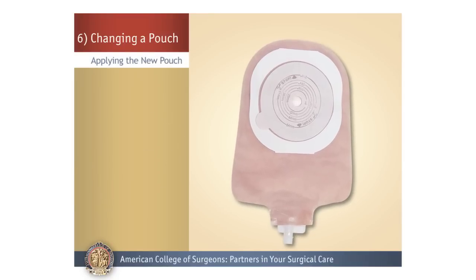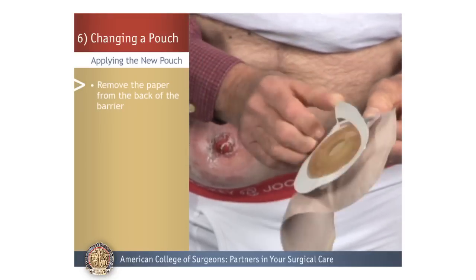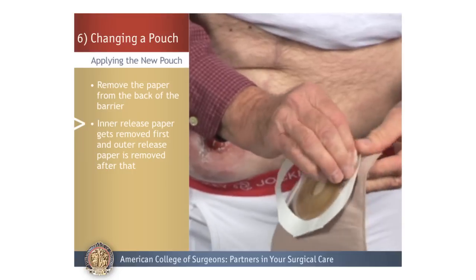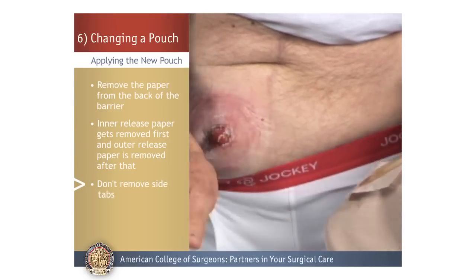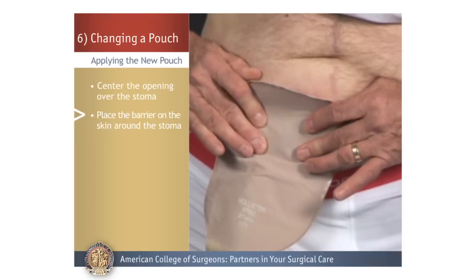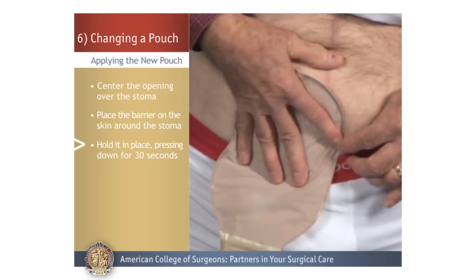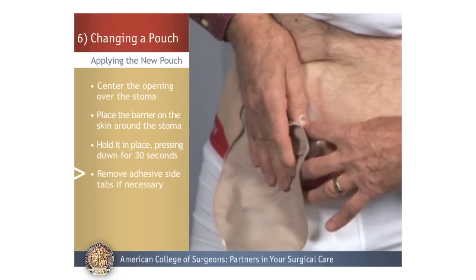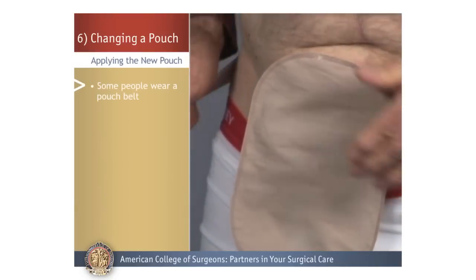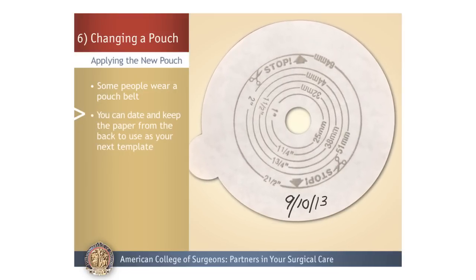Applying the New Pouch. Now you can attach the new appliance. Start by removing the paper from the adhesive back of the barrier — in this case, there is inner release paper that gets removed first and outer release paper that gets removed after that. Do not remove the side tabs. Next, center the cut opening over the stoma, place the barrier on the skin around the stoma, hold it in place, and press down on all sides for about 30 seconds to make sure it is firmly applied. Then remove the adhesive side tabs. Raise the bottom of the pouch and close the opening. Some people wear a pouch belt to secure the pouch. You can date and keep the paper from the back to use as your template for the next pouch change.